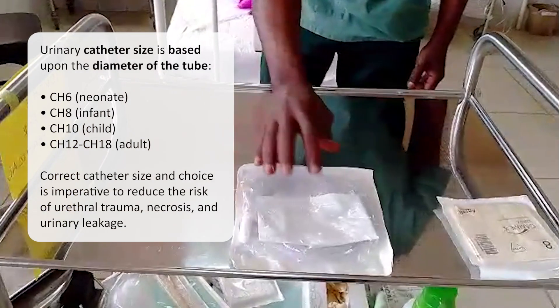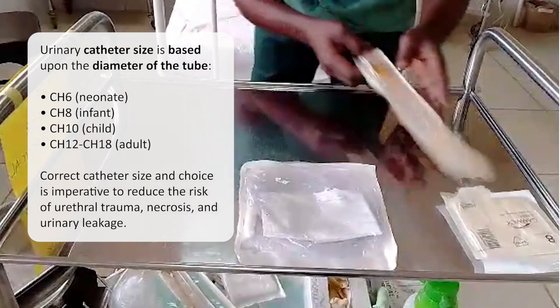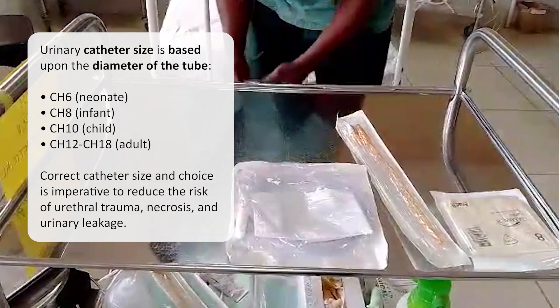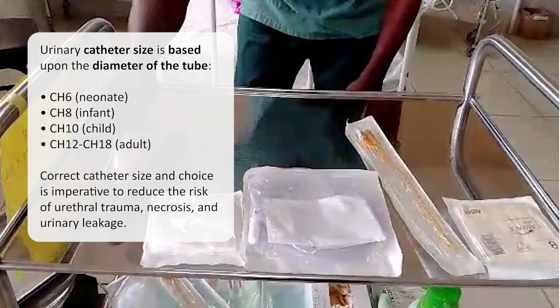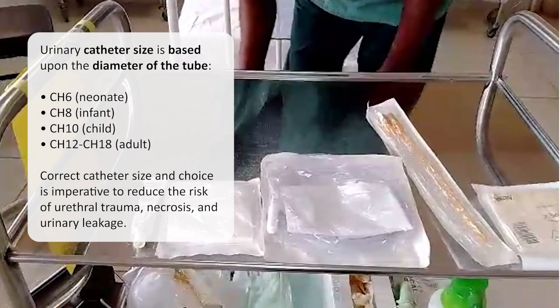Urinary catheter size is based upon the diameter of the tube. For example, we can have size 6, 8, 10, 12, and onward. Correct catheter size and choice is imperative to reduce the risk of urethral trauma, necrosis, and urinary leakage.